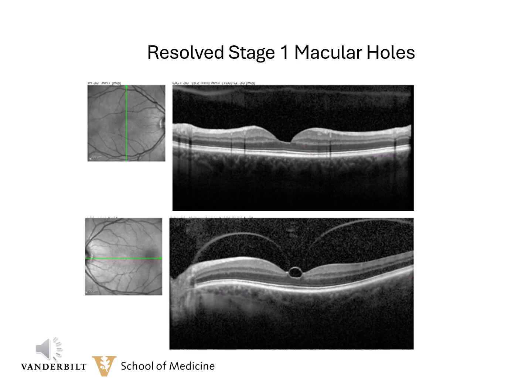But you also, if you look closely at the foveal depression, it is not normal. The bottom is flat and the right side does not match the left side. So my conclusion is that this patient had had a similar picture in the right eye before. However, when the vitreous lifted away, it left this abnormal foveal reflex. Now, sometimes patients will give you a history of some abnormal vision and other times not.